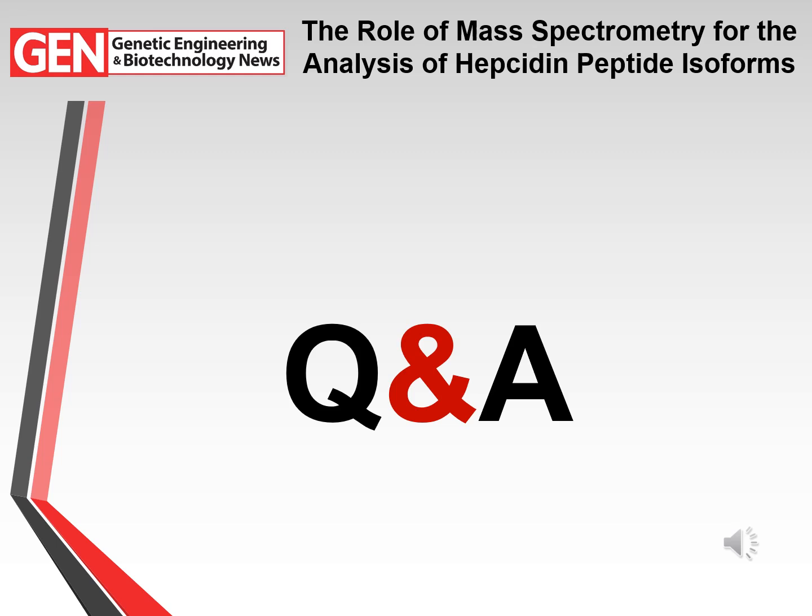I think all problems are solvable, but a lot of the challenges relate to the stringency with which the samples have been collected, the protocols have been followed, and getting them from the collection point into either a -80 freezer or into liquid nitrogen. Certainly once samples have been collected and stored in an appropriate manner, the LC-MS protocols that we have in place are very robust and allow us to get really good quality data.